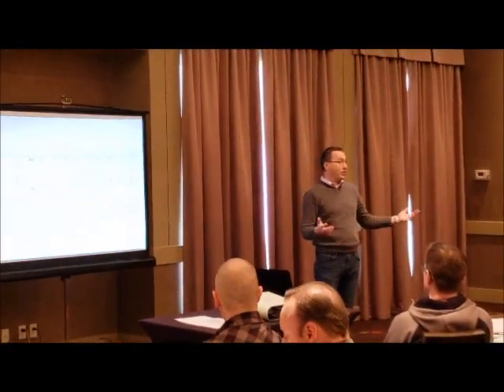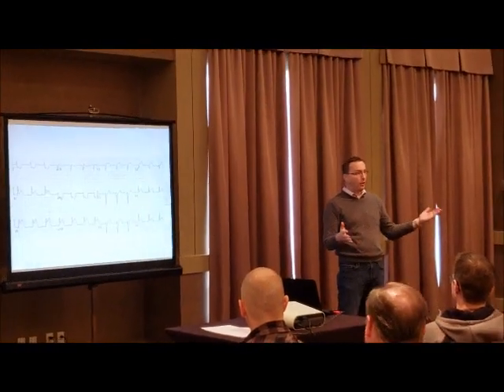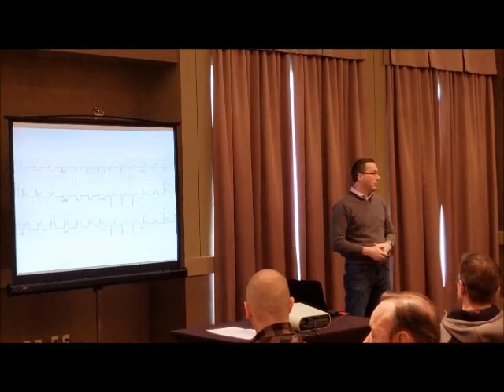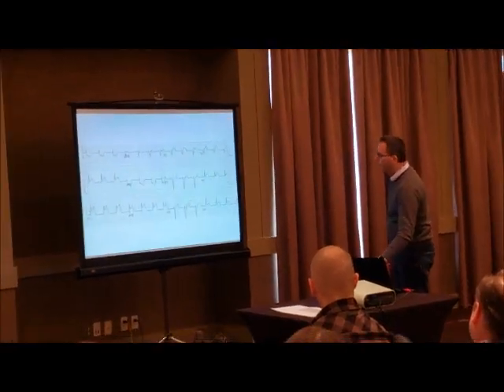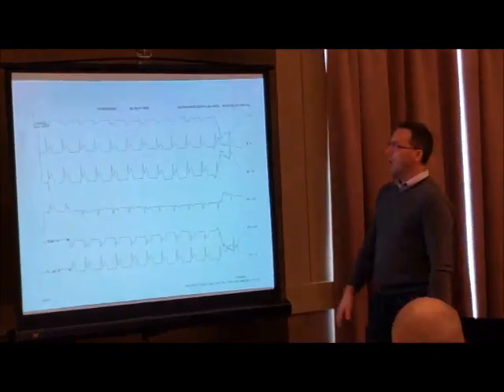So I just walked right in. Hey, do you guys mind if I fill out my patient care report right here in the monitoring room? They're like, no, have a seat. So I watched the procedure, okay? They got the patient attached to the monitor up in the cardiac cath lab, so you can see the amount of ST elevation.